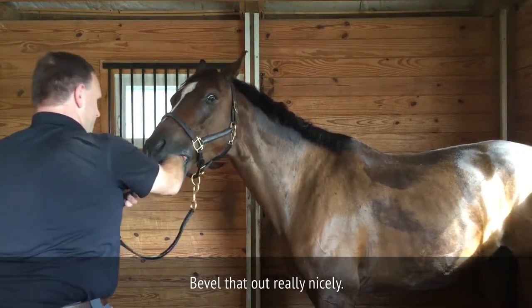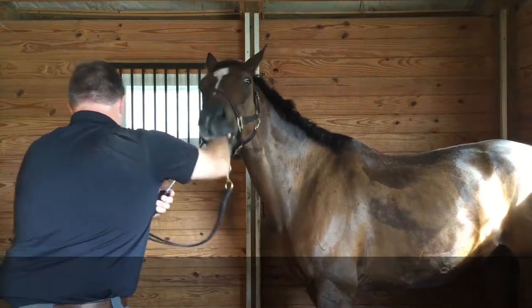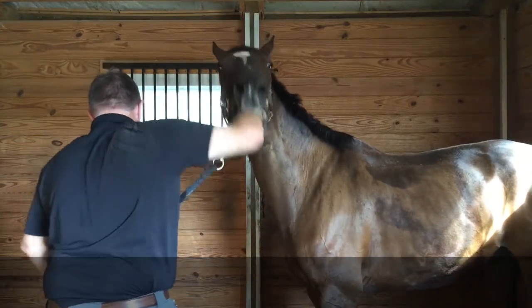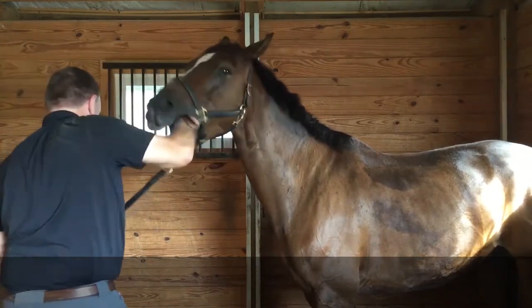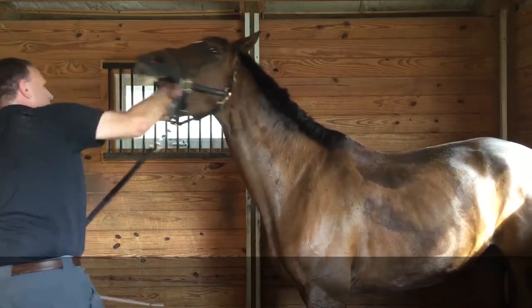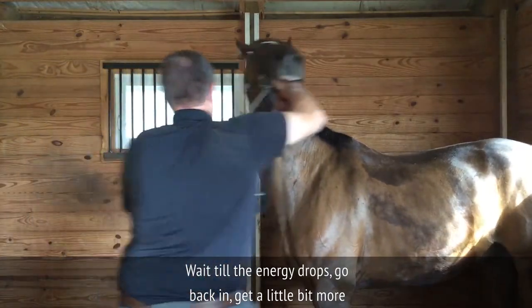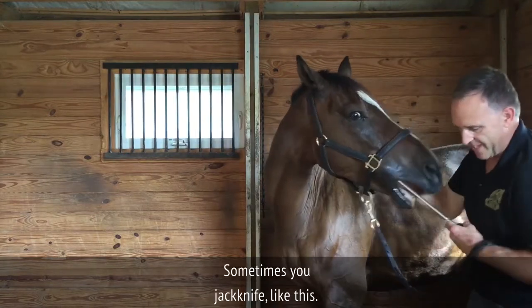There's just a small sharp edge resting right next to the tongue — that'll pull out really nicely. The palatal side of the upper cheek teeth. This is what we call squirming in the dentist chair. So I just wait — wait until the energy drops, go back in, get a little bit more done. Sometimes you jackknife like this.